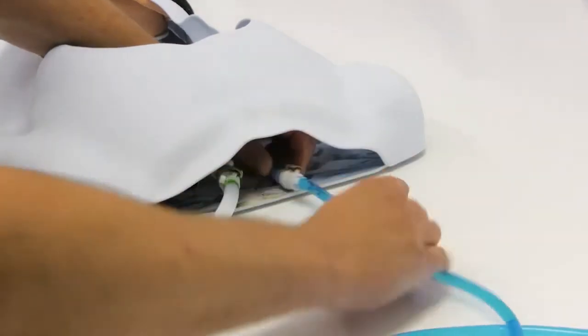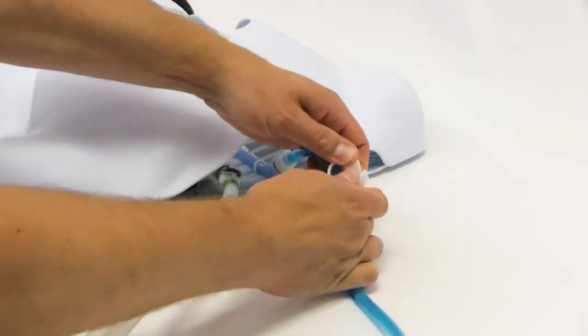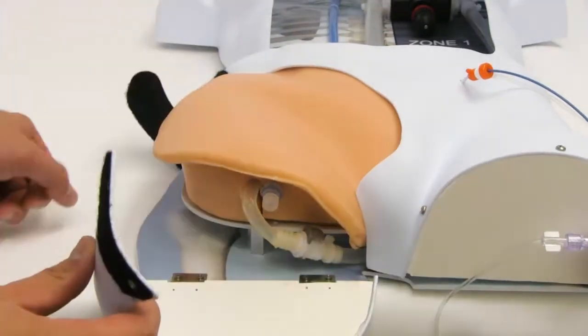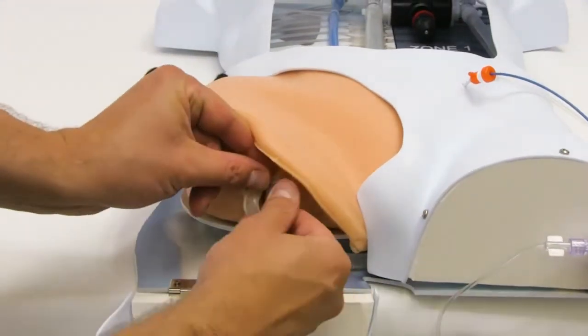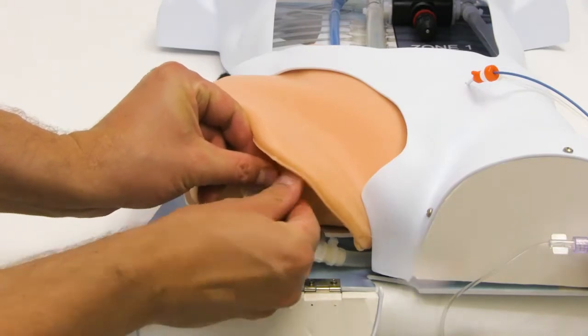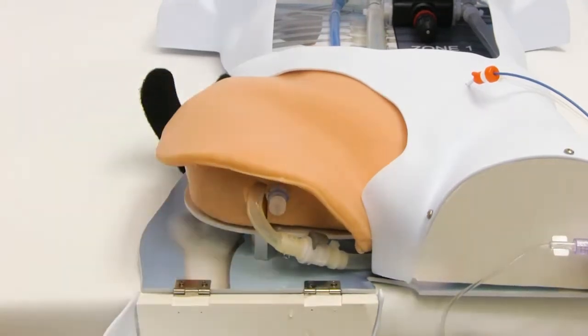Connect the bladder extension line to the vena cava in the body model. Open the clamp on the extension line. Open the thigh patch cover on the model to expose the back of the thigh patch. Carefully unscrew the cap at the end of the blue tubing in the back of the thigh patch. Bleed the air out of the vena cava and then replace the cap.